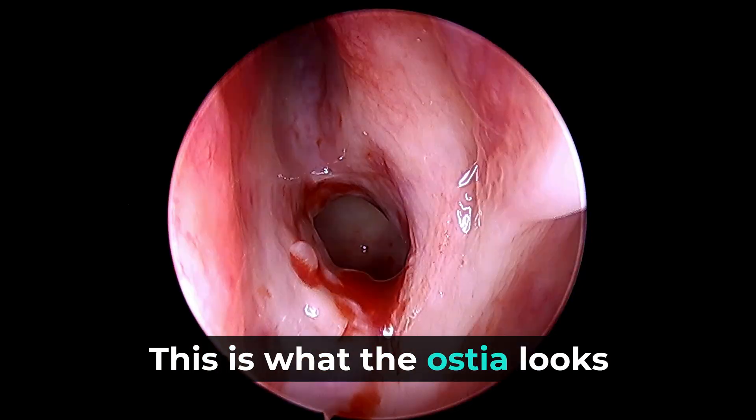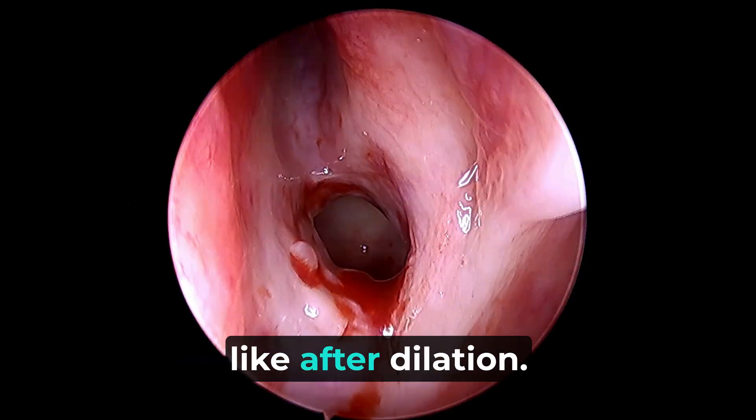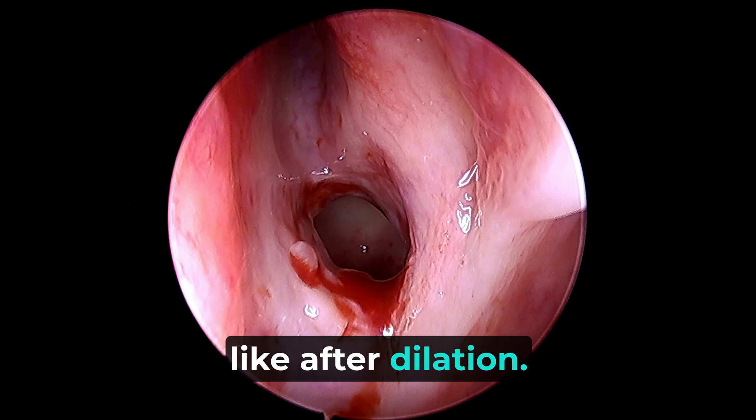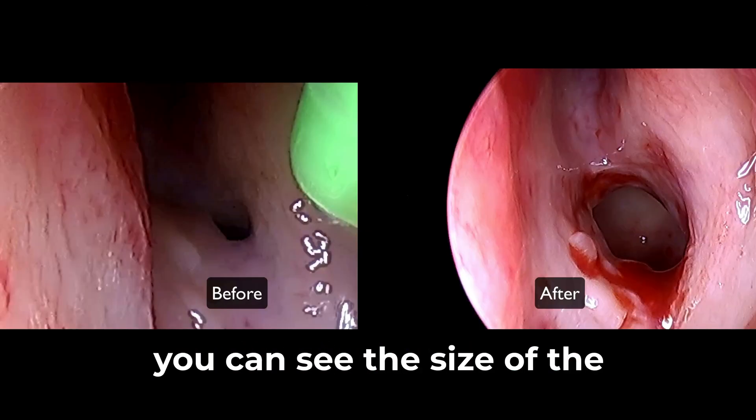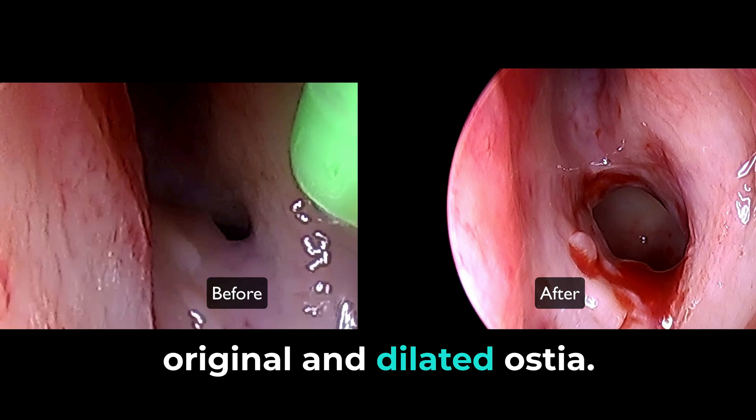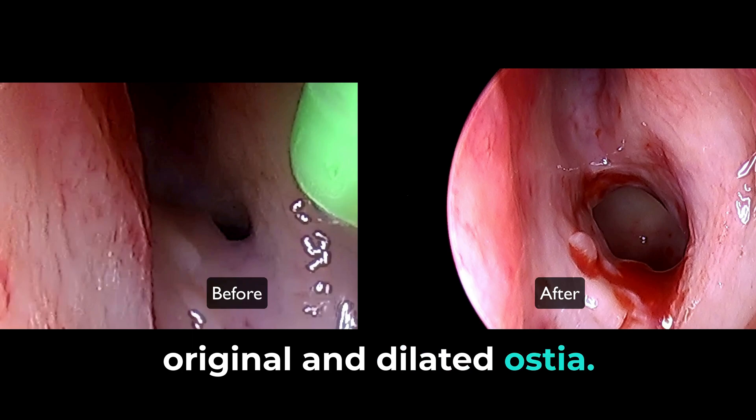This is what the ostia looks like after dilation. In this comparison view, you can see the size of the original and dilated ostia.